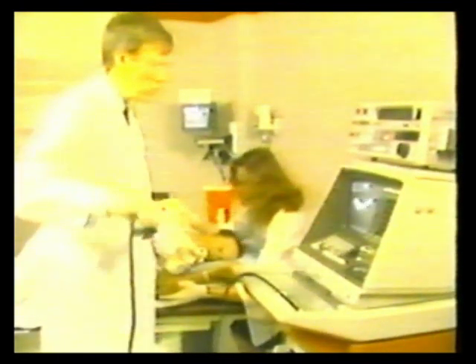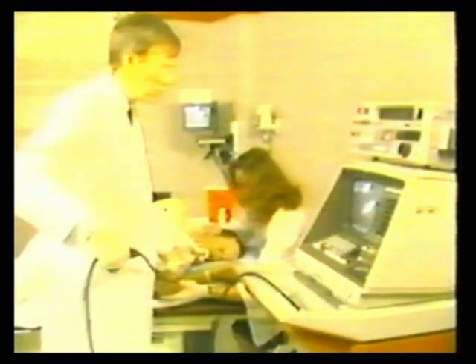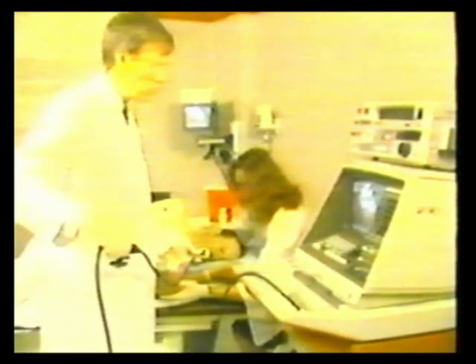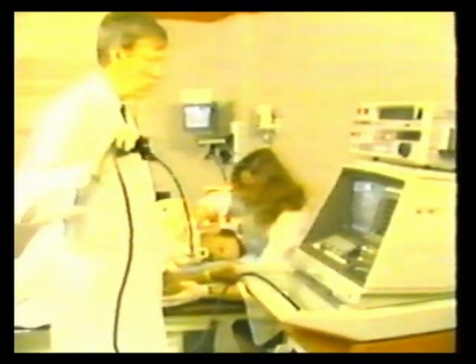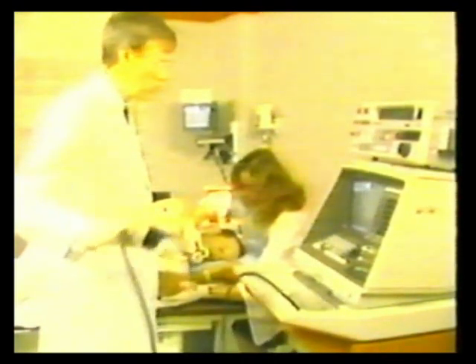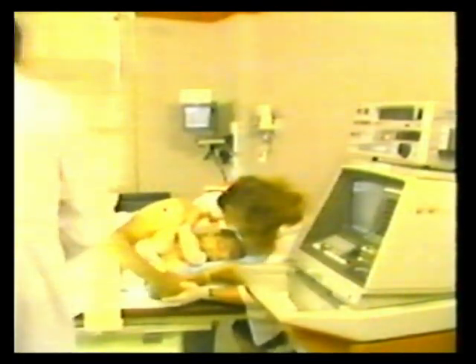Presently, approximately 1% of patients do not tolerate esophageal intubation in our echocardiography laboratory. A gastroenterologist can be helpful in these circumstances. At the termination of the examination, the scope is washed and cleaned of adherent material and then sterilized with a glutaraldehyde solution.